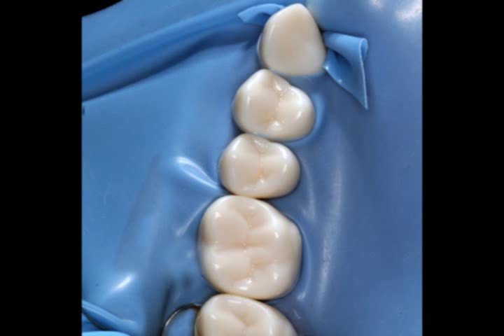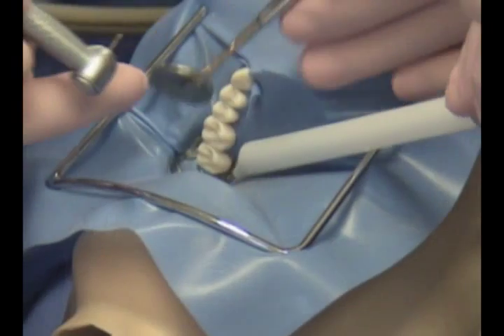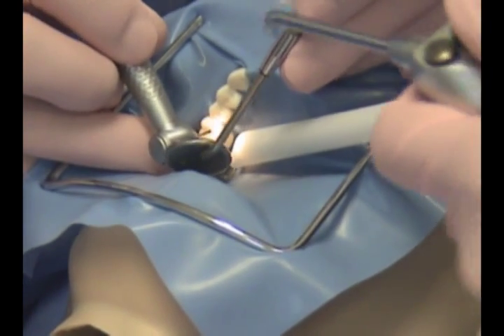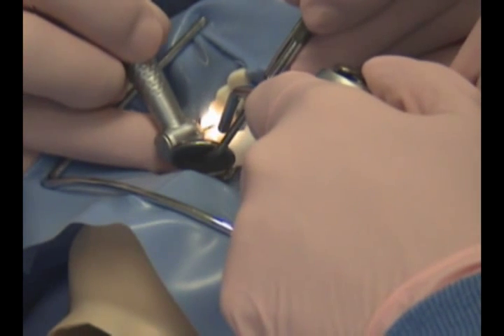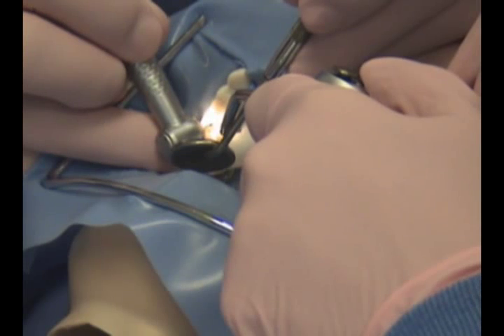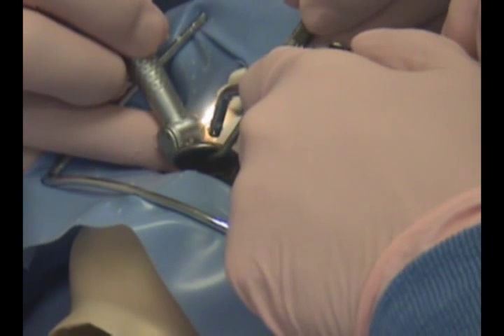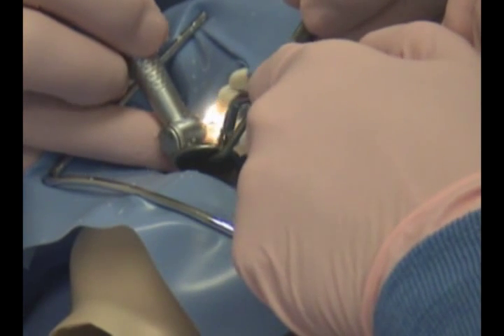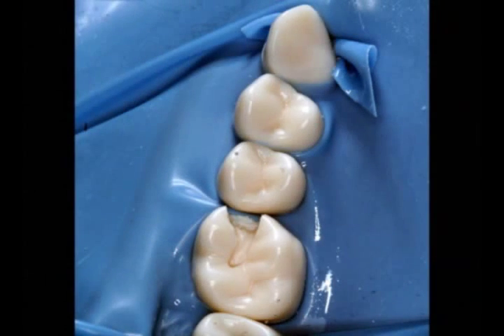Tooth number 3 is now isolated and the preparation will begin. The initial tooth preparation will be done with a high speed handpiece. When a maxillary tooth is prepared, the dental assistant must maintain a clear field. You will notice that the dental assistant is using the high evacuation suction as well as the air water syringe, which is being used to blow an air water mixture onto the operator's mirror. Once the tooth is prepared, the dental assistant will irrigate the area to remove any debris.